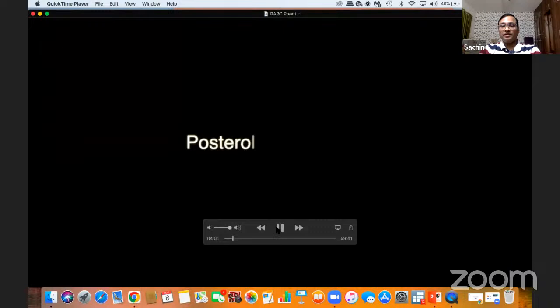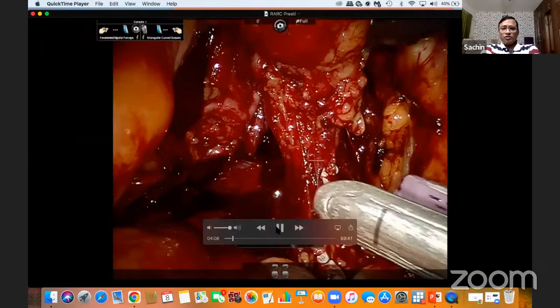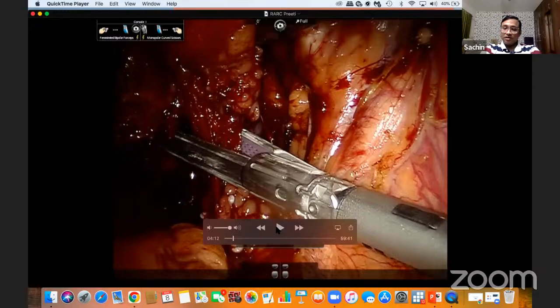Then the posterior pedicle, the vas deferens, is cut, coagulated and divided. There are two or three ways of doing this. One is we can use the LigaSure, Harmonic or ThunderBeat to take care of these pedicles. Or you can use an endo-GI stapler, or you can use Hem-o-lok clips. My preference is Hem-o-lok. Sometimes I use endo-GI staplers. I don't have good experience with the use of LigaSure, ThunderBeat, or ultrasound.